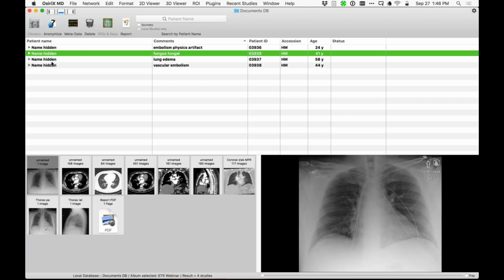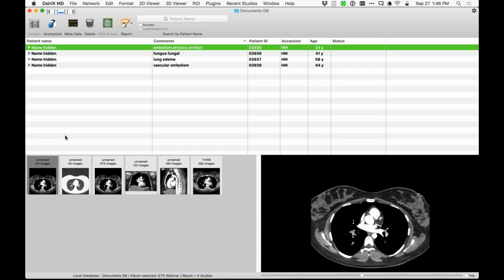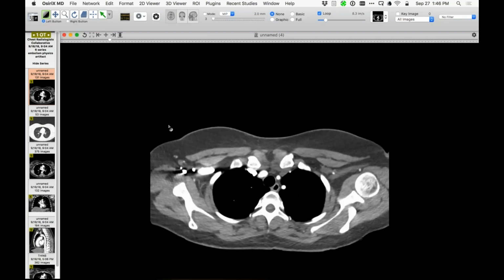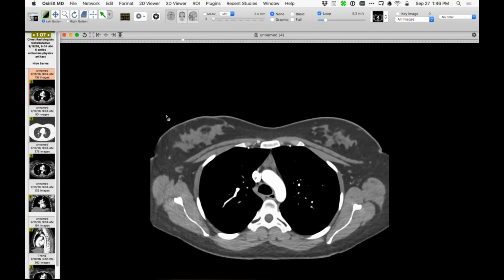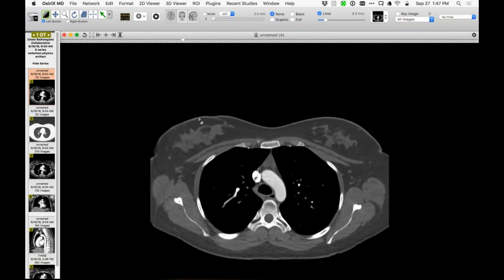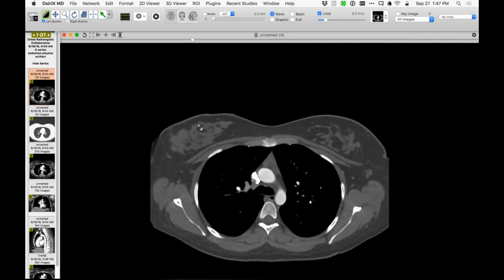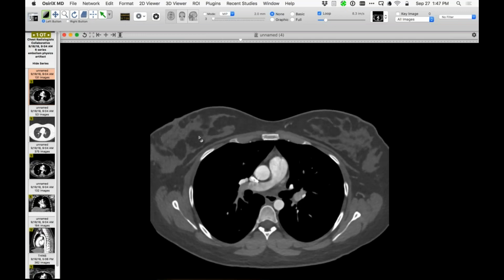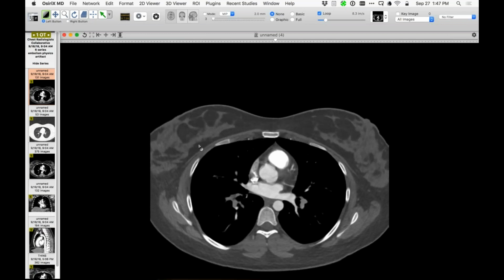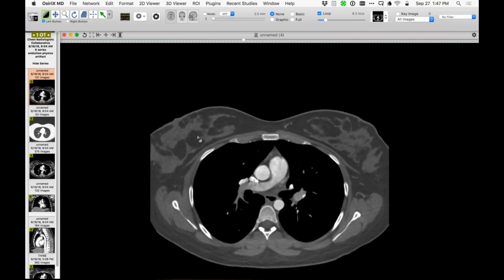This one I'm going to show, we've seen this one before, but it's such a nice example, and I sent this one to you guys earlier, of the so-called interrupted bolus artifact. So we have a fast scanner. These scans for pulmonary embolism are completed in less than a second. And what's dramatic about this is that you can literally see the bolus of non-opacified blood, a discrete bolus of it in the pulmonary arteries.